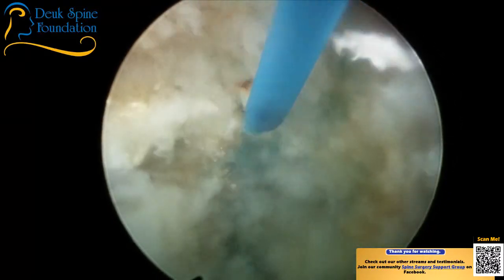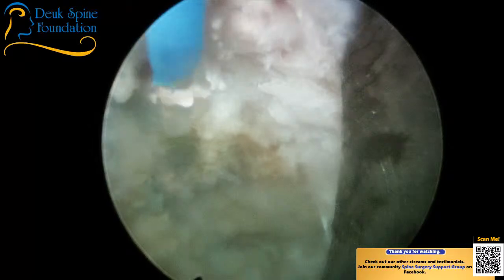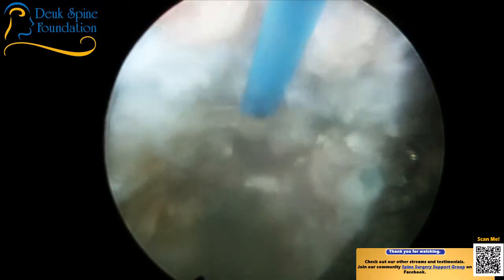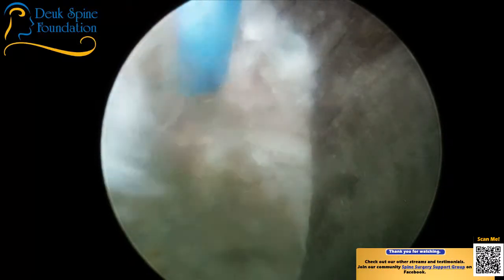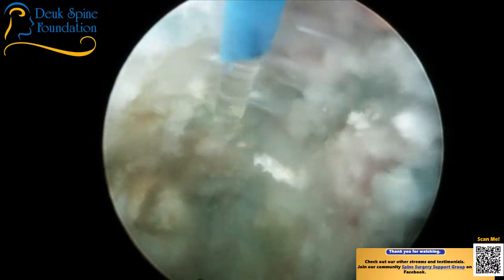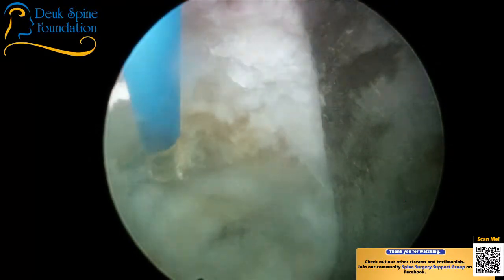All right, so just about done here with this disc. I think she's going to be very, very happy when she's healed up. All right, we're just finishing up at L4-5. We're going to do L5-S1 next. L5-S1 is pretty collapsed, so there's not a lot of herniation there to take out. But there's going to be a tear that needs to be fixed. And that's what we're going to focus on at L5-S1, the annular tear, just like we did here. This disc definitely had a bigger herniation.